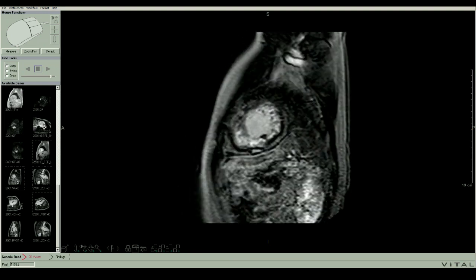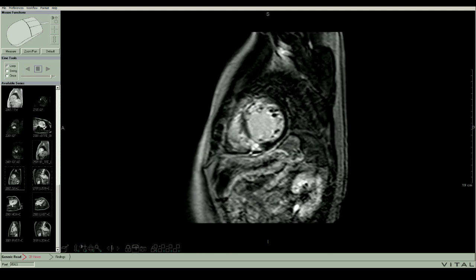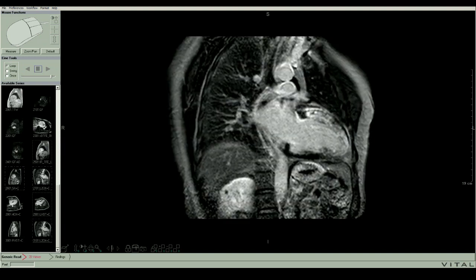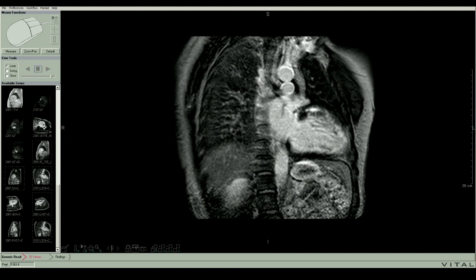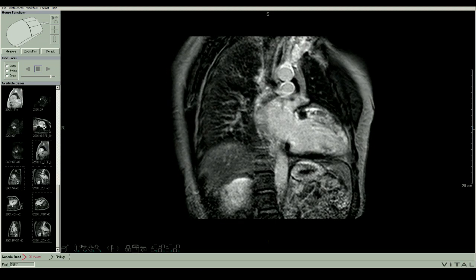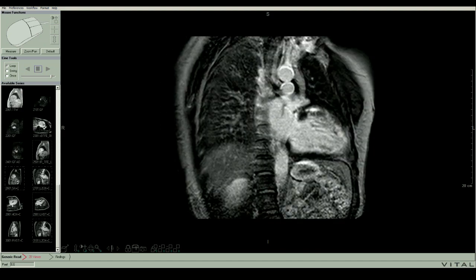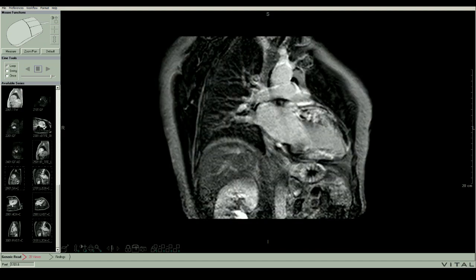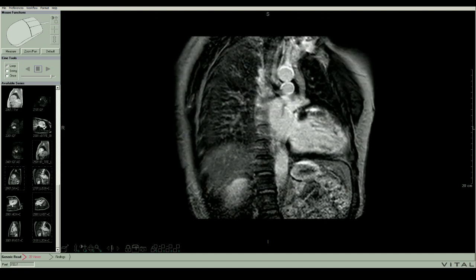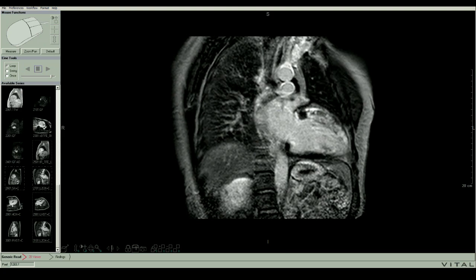And then this is probably normal in here because that's the trabeculae. Already seen that one. Haven't seen this one. Again, anterior, septal, anterior wall, apical, subendocardial, transmural. Even here in the lateral wall. And then bunches of normal, so it's not amyloid. You see bunches of normal, it's not amyloid.